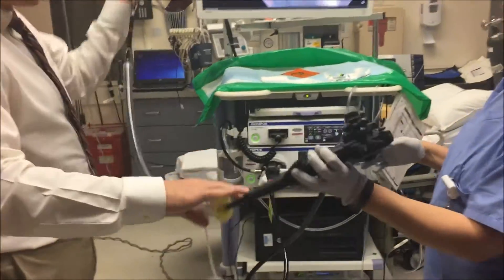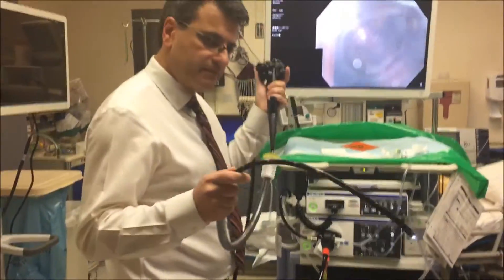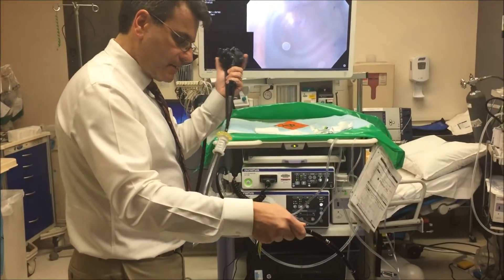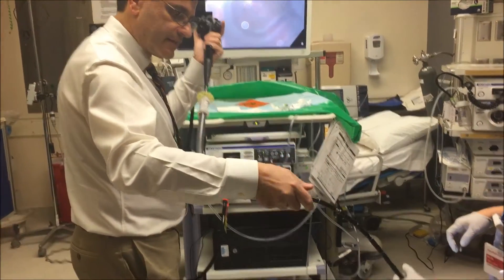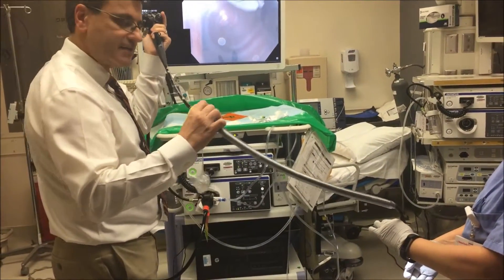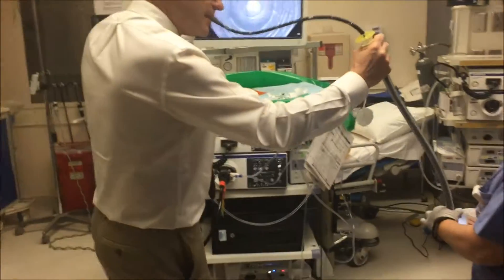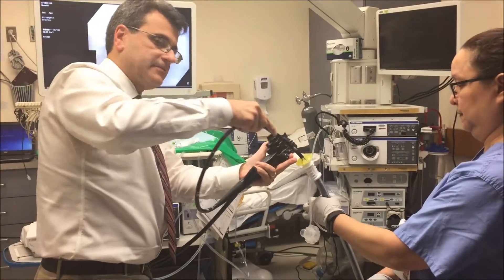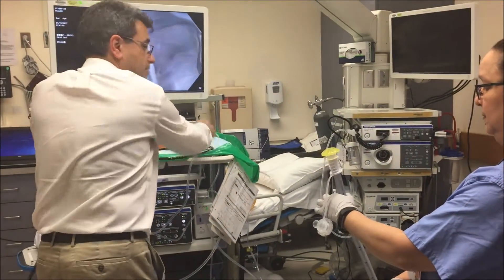We bring this all the way to the back, and now the gastroenterologist — the endoscopist — passes the scope. You just take a look just like you're doing a regular scope. Once it's in, now you want to position the overtube. We're just pretending that's the patient's mouth — so then we slide this down and you have to slide it in. Now it's in, and now you take the scope out. So now it's in the esophagus, coming out of the patient's mouth basically.